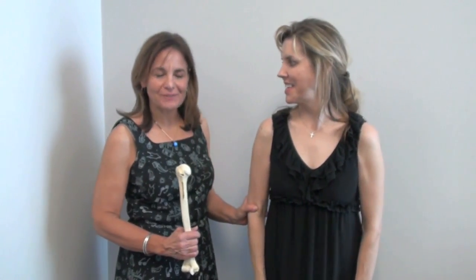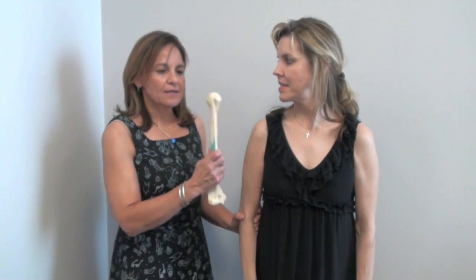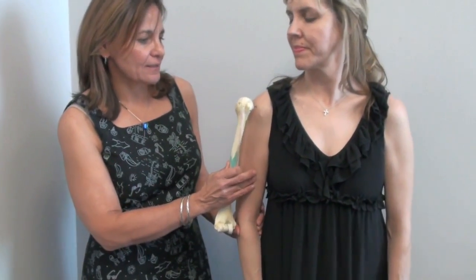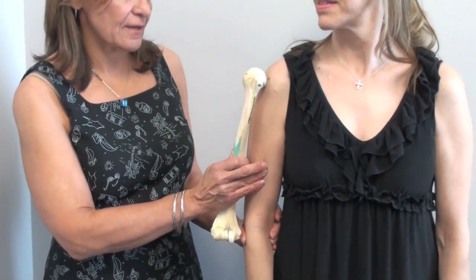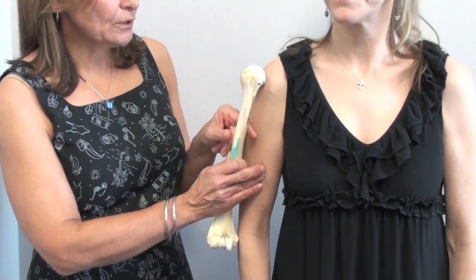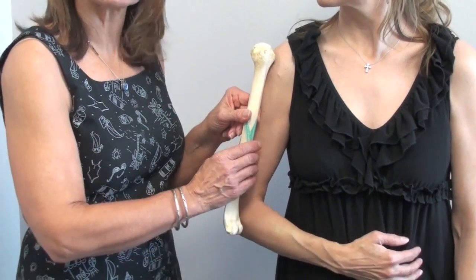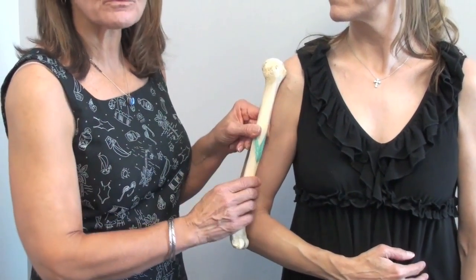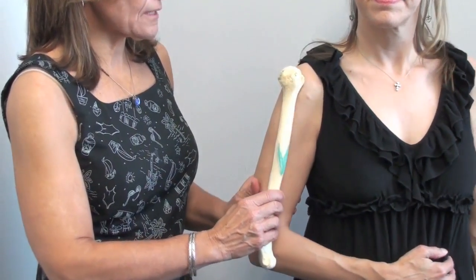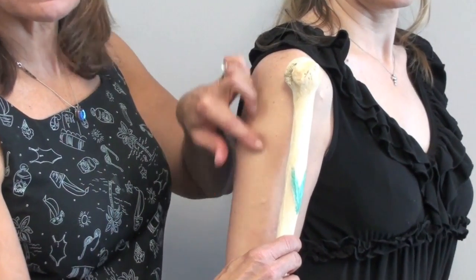I'm going to demonstrate locating the proper anatomy for the proximal humerus insertion on our model. She's standing with her arm normally, the way she would if she was walking. With this human humerus, you can see that it normally lies at this angle. When you put the arm in the position that's ideal for insertion, it rotates the humerus medially and protects the sulcus, which we want to avoid. From the side, you can see that the humerus lies anterior to the midline of the arm.